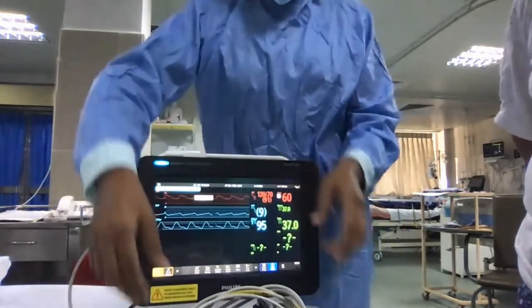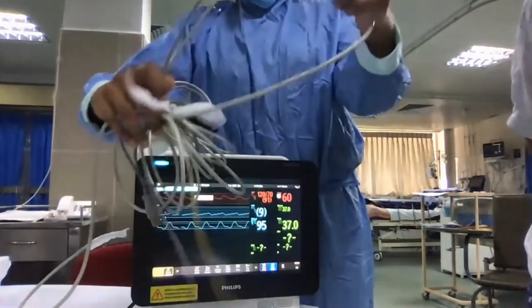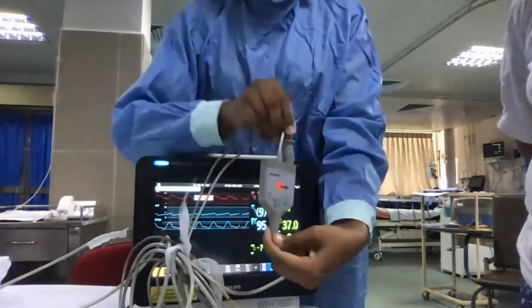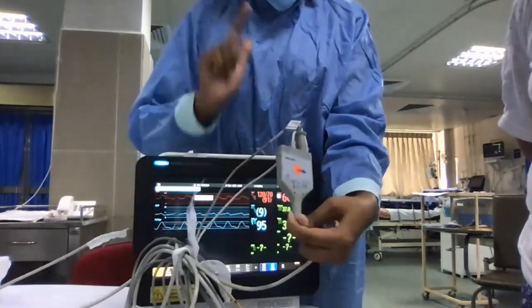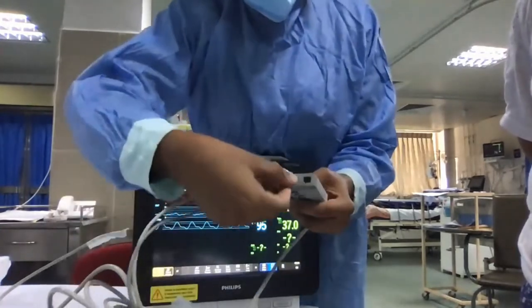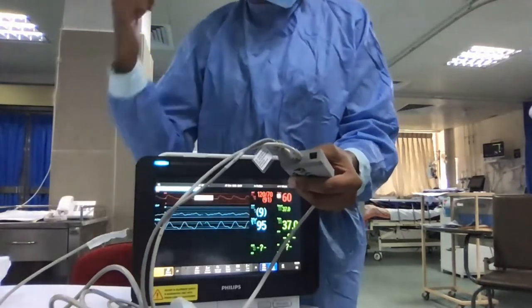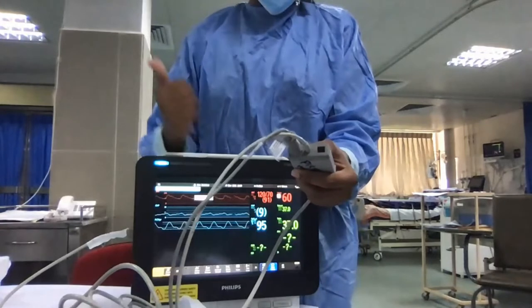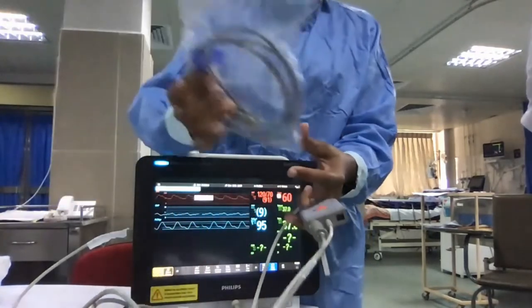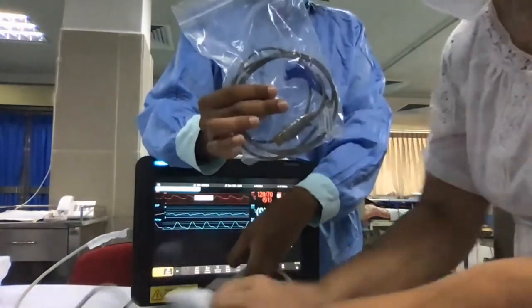And then we need to have the cardiac output cable, that is this. If you can see, this is the PiCCO cardiac output cable, the Philips one. And then there is a port over here. That is the port which gets connected to the CVP line of the patient. So we insert a blue color PiCCO temperature probe. So this is the PiCCO temperature probe, the blue color one.